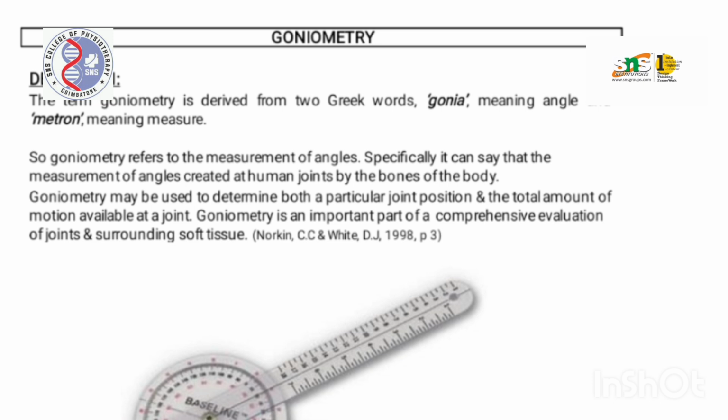In 1912, the physicist Max von Laue used the goniometer to aid in the investigation of the atomic structure of crystals. It is used for a different purpose. In physical therapy, the goniometer is used to measure the range of motion in patients. Therapists can determine what it is before therapy begins and how it progresses with therapy.